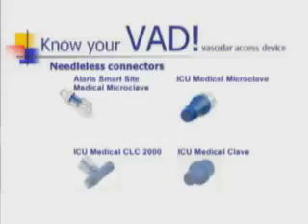In 2007, there were 7 different needleless connectors in use within Fletcher Allen. These included negative, neutral, and positive displacement connectors, each with different technical characteristics and flushing requirements. The Jeffords Quality Institute Central Line FMEA chose to implement one standard needleless connector at Fletcher Allen Healthcare. We have changed from the Smart Site needleless connector to MicroClave.